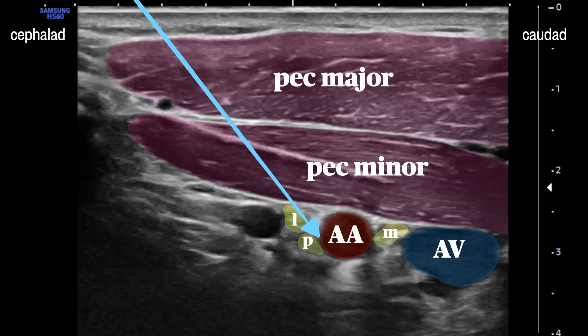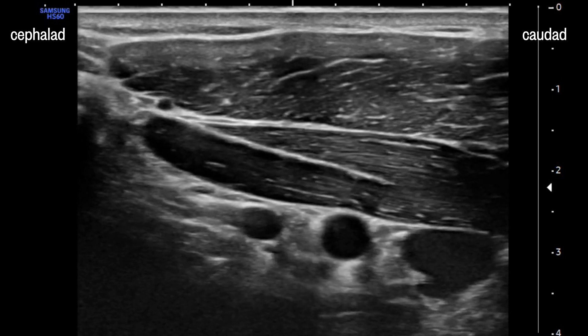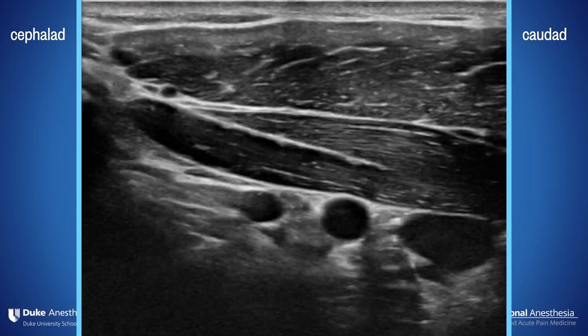The goal of the block is to advance a needle from the cephalad aspect through the pec muscles and land the needle tip just deep to the artery at the six o'clock position. Things are clustered tightly here, and you'll want to make good use of hydrodissection to keep those cords clear of the needle path. It's often the case that you can see your artery well but don't have a clear image of any of the cords — and the great thing about this block is it doesn't matter. If you put your local at six o'clock, you'll be in great shape.